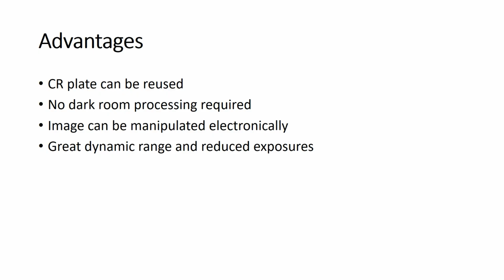In conventional radiography, we cannot change the contrast of the image, but in the CR system, the major advantage is that you can manipulate the image electronically. Then you get a great dynamic range of image. Due to that, you can reduce the exposure factor.